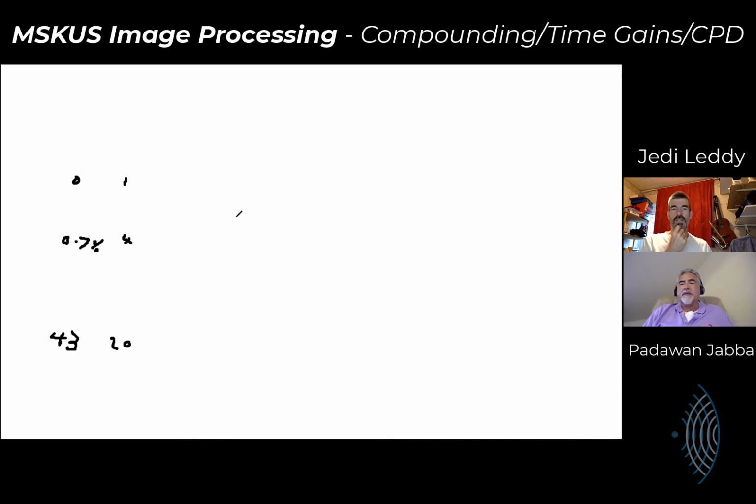So what you do is you have something that looks like a curve like that. With increasing strength of reflection, you get a small reflector there, and then your strong reflectors there, and they get brighter and brighter. Then it doesn't really matter how much brighter you get.